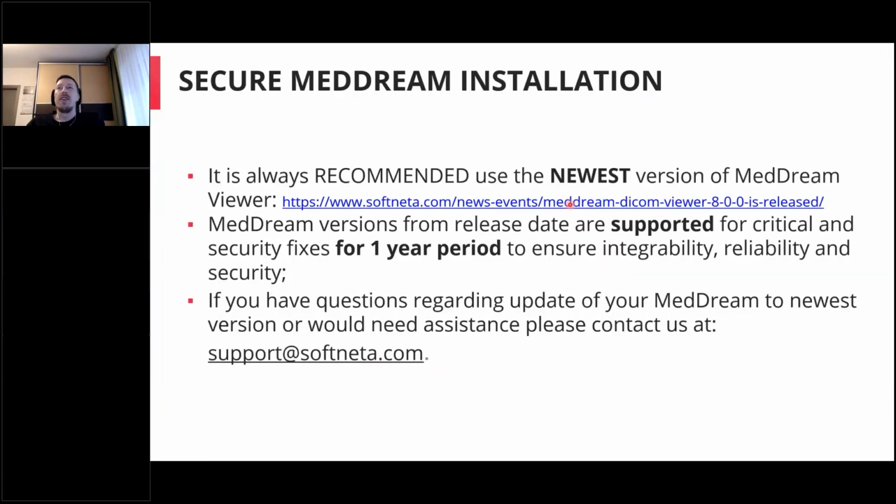Of course, it's not a new thing, but it's always recommended to use the newest version of MedDream Viewer. As you maybe saw, we just released version 8.0. And as Renata mentioned, next week Vytautas will do a presentation about the new functionalities. So we really invite you to join this webinar also.